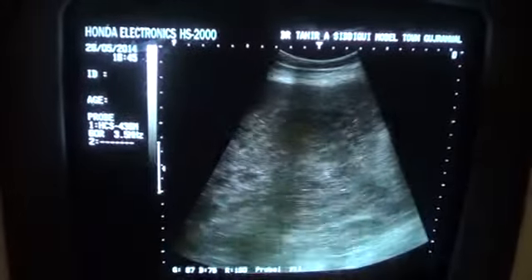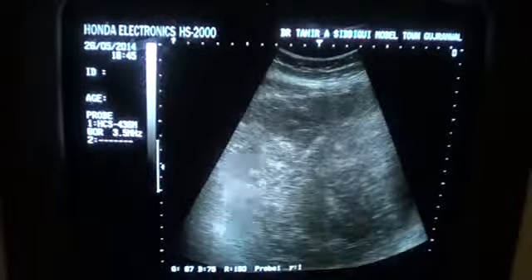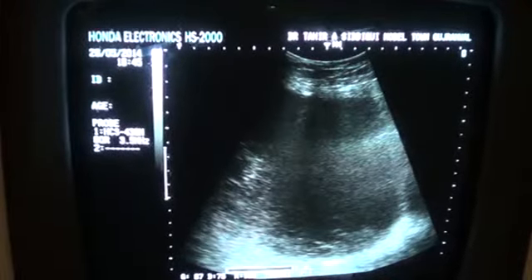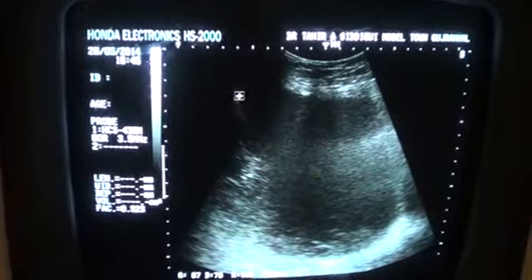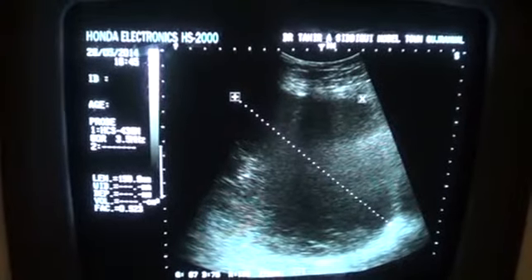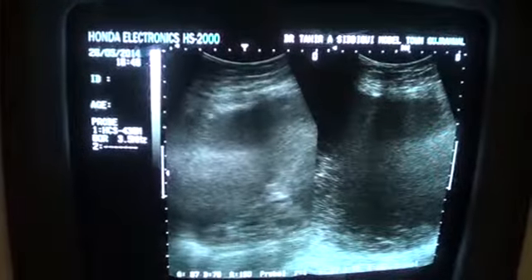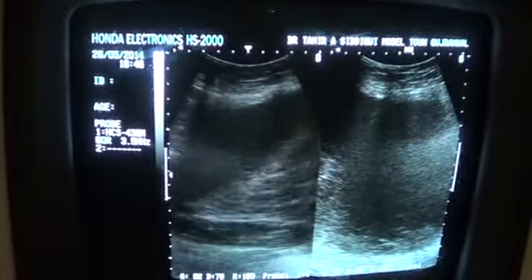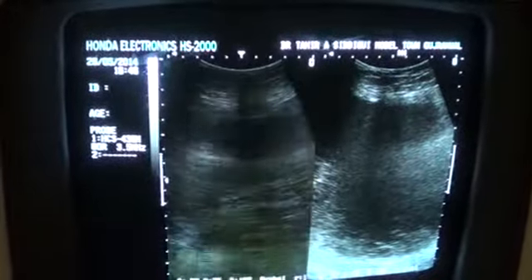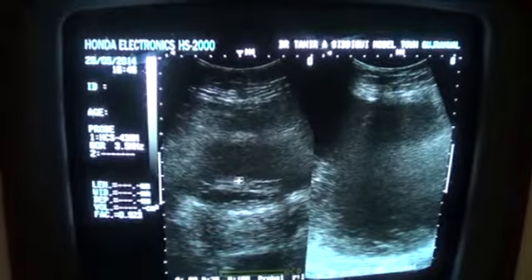The upper portion of this mass is a bit clear of septas. This portion is total fluid, and the fluid volume is approximately, okay, I can just have a rough idea.